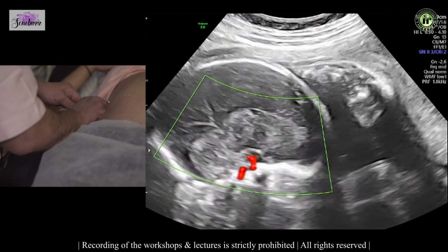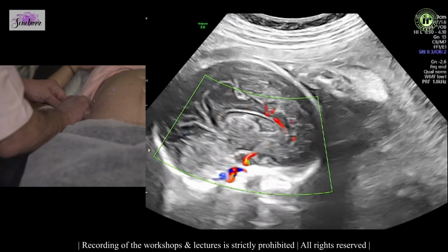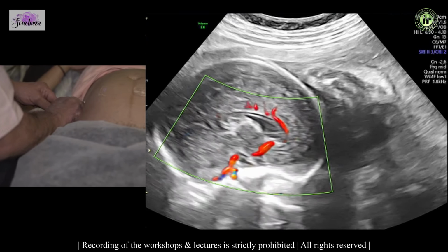And that was with power Doppler. This is with regular color Doppler. You can see the difference that power Doppler makes.